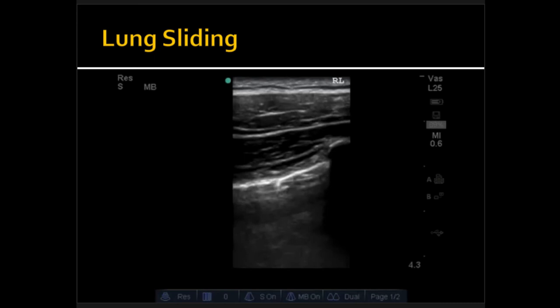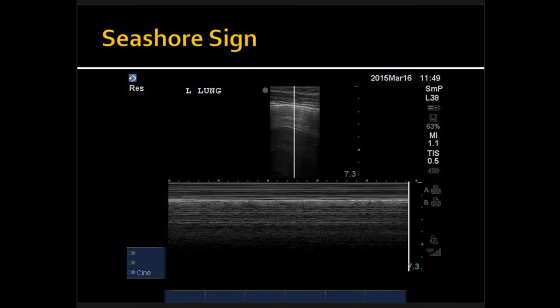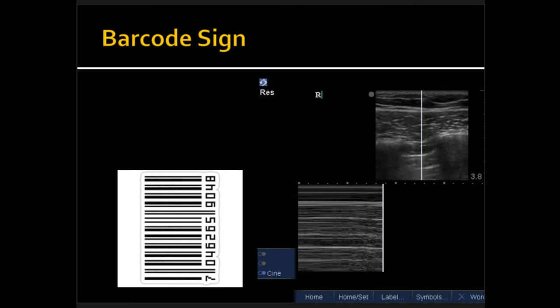You do M-mode. You take the BAT sign — two ribs with the pleural line — press M-mode, place the vertical cursor at the center of the pleural line, press M-mode again, and you get a one-dimensional view of the lung surfaces during respiration. You get the seashore sign, which rules out pneumothorax at that location. Move down to the next rib and repeat. If you have high clinical suspicion and see a barcode sign, it indicates that the lung surfaces are not moving during respiration — suggesting highly a pneumothorax.